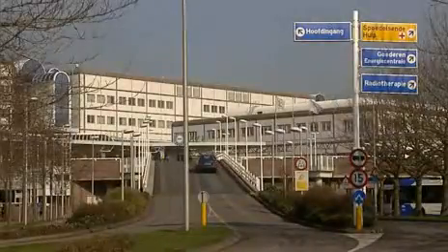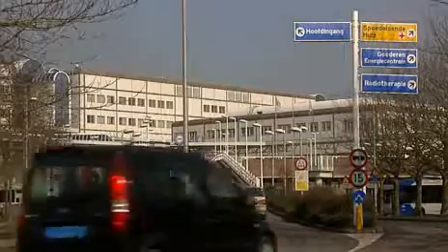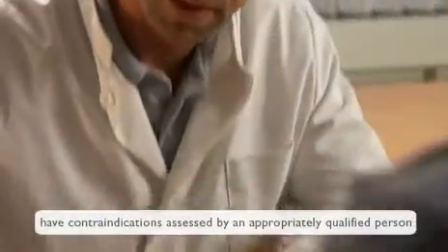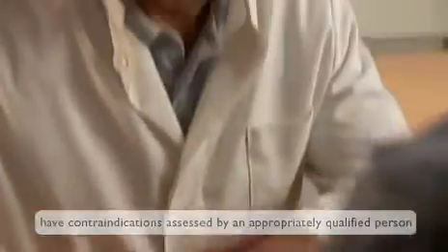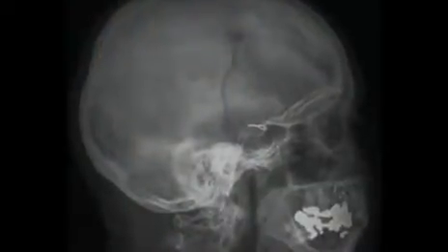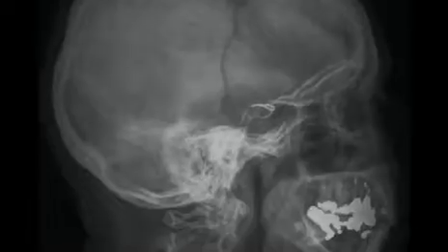Contraindications. Contraindications are conditions that might pose a hazard to the patient. They must be assessed by a qualified person prior to the examination. Ferromagnetic implants, such as aneurysm clips, and electronically active or passive implants, such as pacemakers and deep brain stimulators, are in principle contraindications for MR scanning.